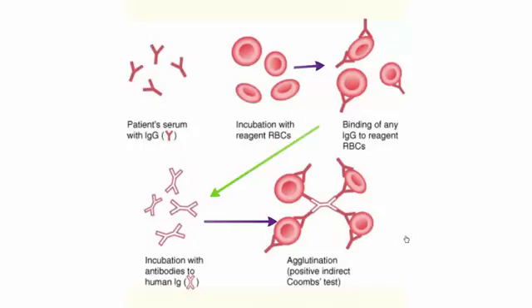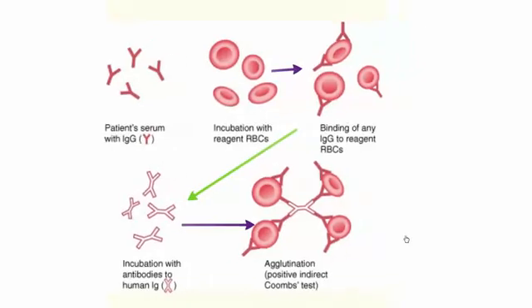First, we will take the patient serum and then we will incubate the patient serum with the normal RBC, or we call it reagent RBC.